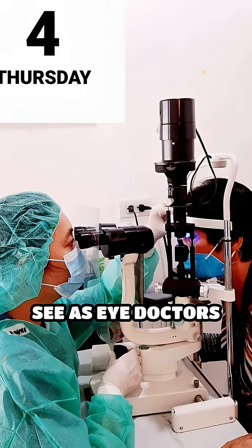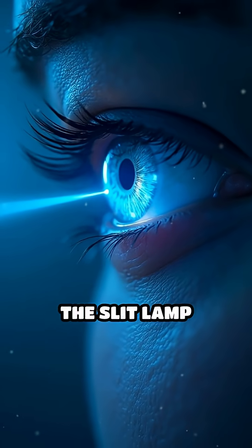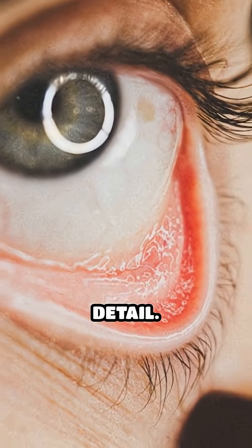Have you ever wondered what we see as eye doctors when we look at your eye under the slit lamp? The slit lamp examination is a key procedure to inspect the front parts of the eye in remarkable detail.